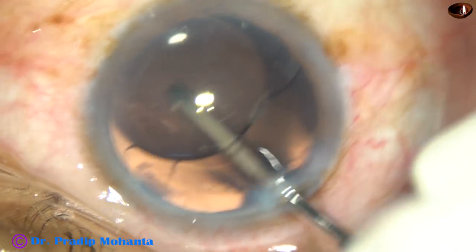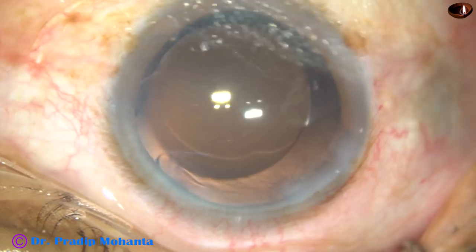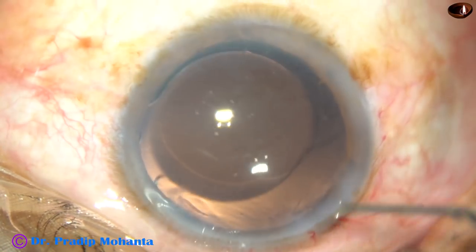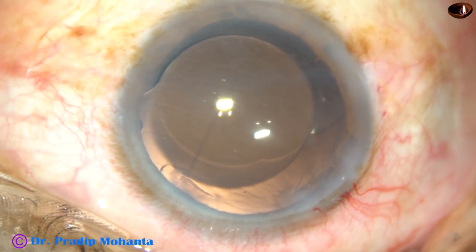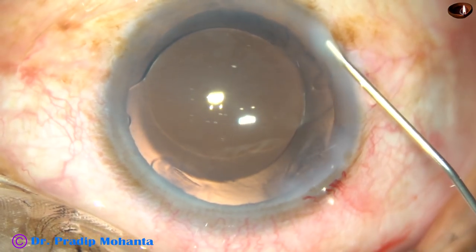Go behind the intraocular lens and remove the visco — viscoelastic which was there in the lumen of the cartridge. And now this is a bit of moxifloxacin. And now, hydrate the sideports.